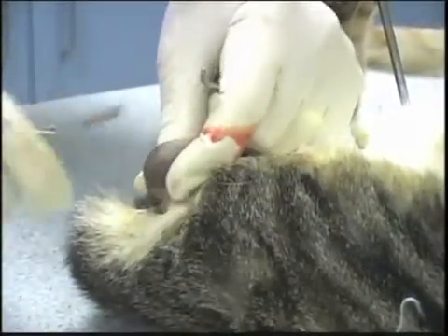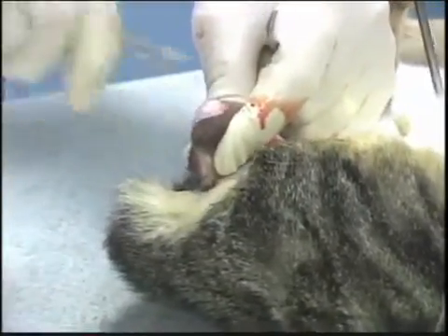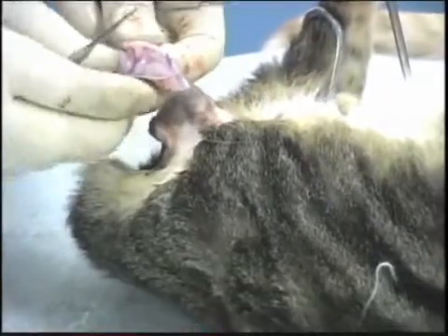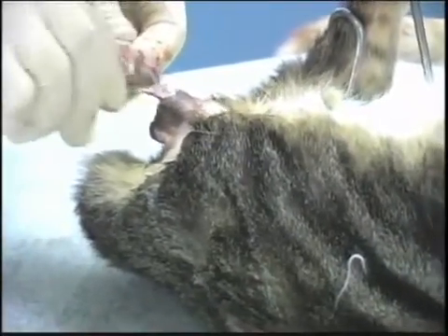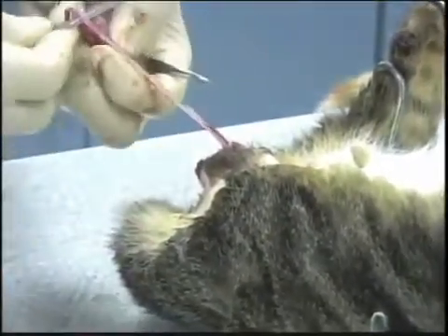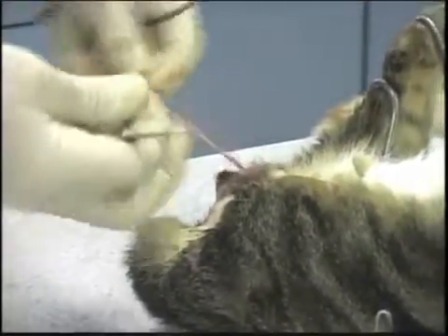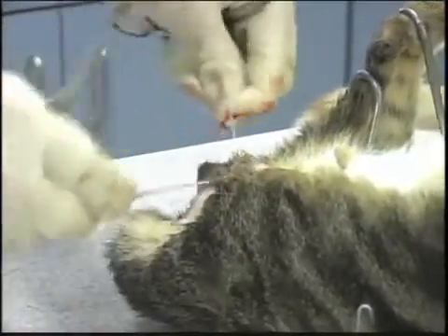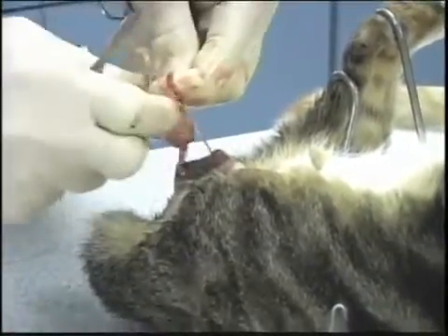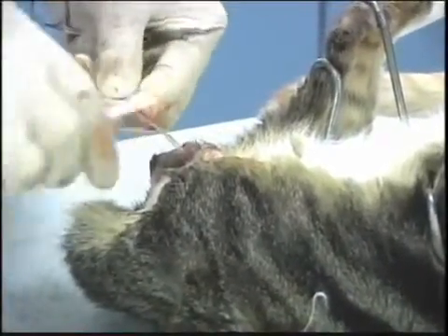The other technique is to actually use an open castration, where you let the testicle come out of its tunic. Cut the tunic away. Now you're going to separate the testicle and the vessels from the vas deferens. And do a series of overhand knots which will then create the ligature — the self ligature. And then cut away.